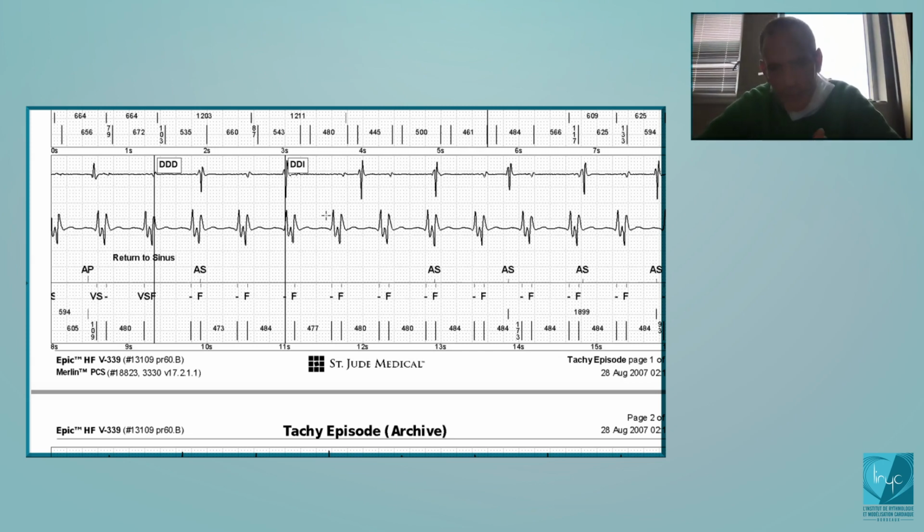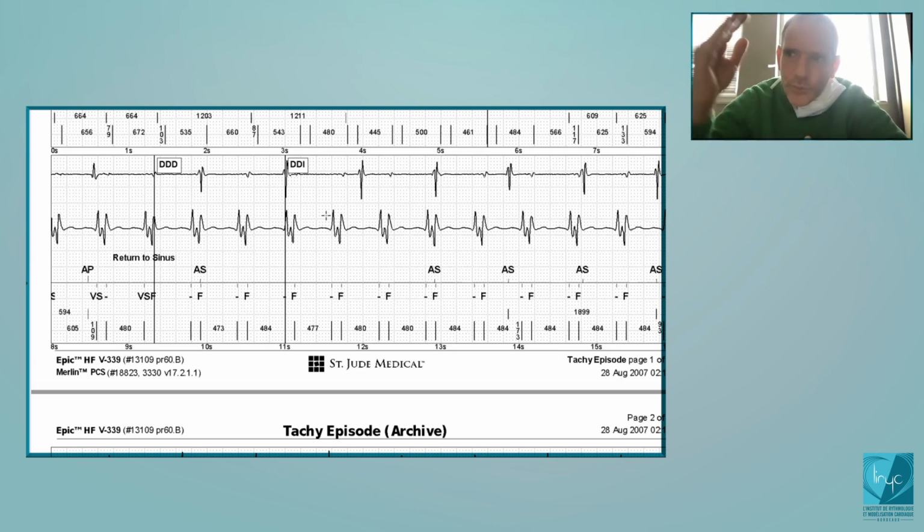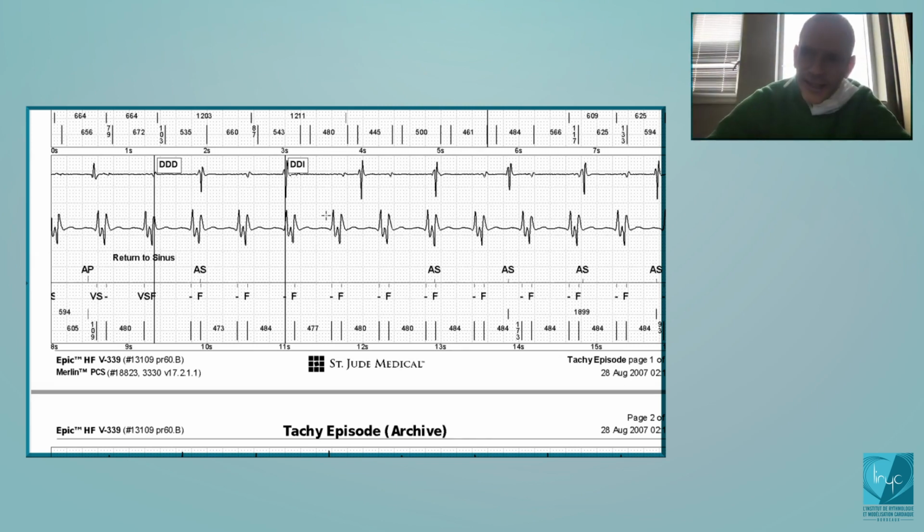You can program it in Medtronic also. It's nominally 120 in Medtronic, but you can program it up to 170 milliseconds. Yes. You can program it in Biotronik, but you need a code. It's only people from Biotronik. You can ask them, they have a code, and then you can modify this parameter. And you cannot reprogram it in Boston and in MicroPort. There's no access for programming this parameter.